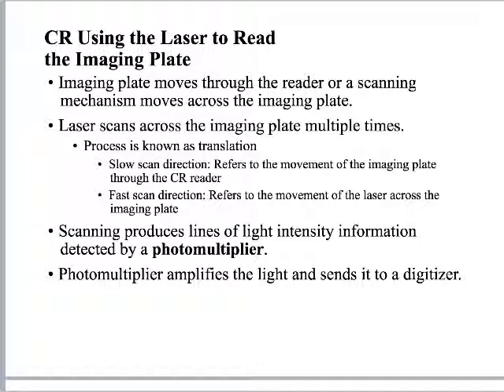And this is going to produce light out of that photostimulable phosphor. And then what we're going to do is amplify that light. There's a little thing that comes right after the laser called a photomultiplier. It just scans over, seeking that blue light. And wherever it sees the blue light come off the PSP plate, it amplifies it.